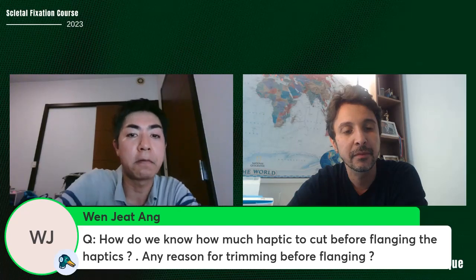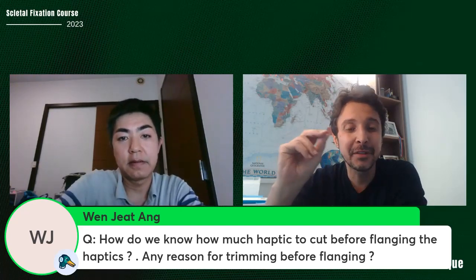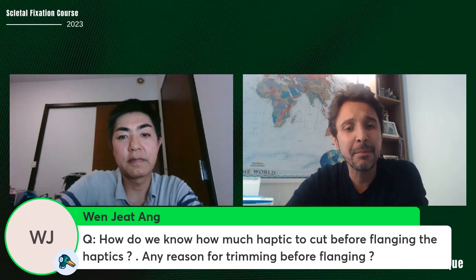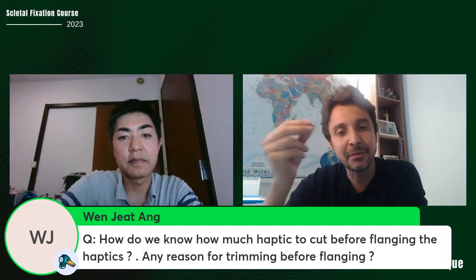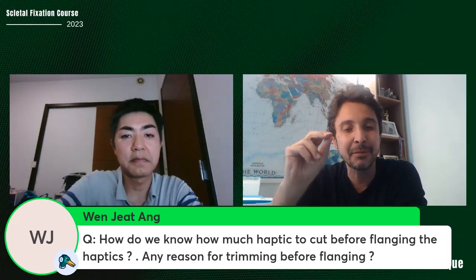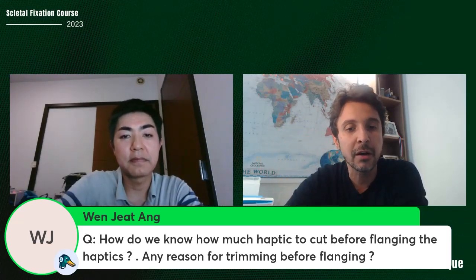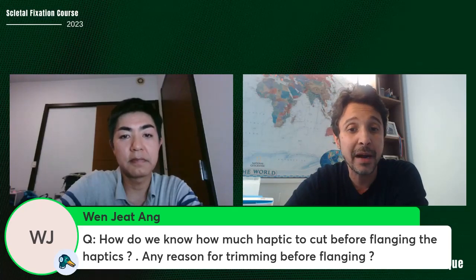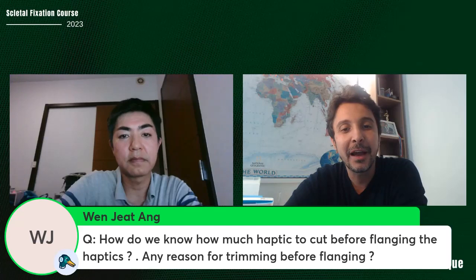Why don't you use Alcon? I don't like the haptic of the Alcon. I think the haptic is so thin, and when I perform with this Alcon lens, sometimes the haptic bends or breaks, and the Sensar haptic is better, is stronger, and my results with the Sensar J&J are really the best compared with the Alcon. I don't know if it is only my personal experience, but my dream is to have the Japan IOL here in Brazil.